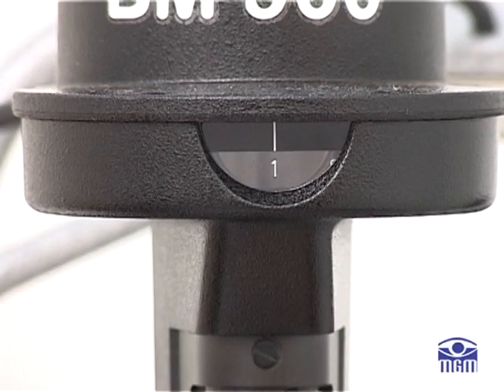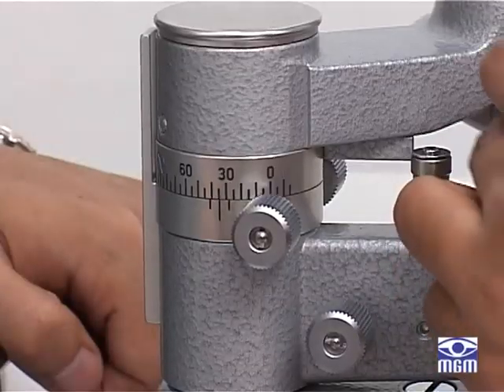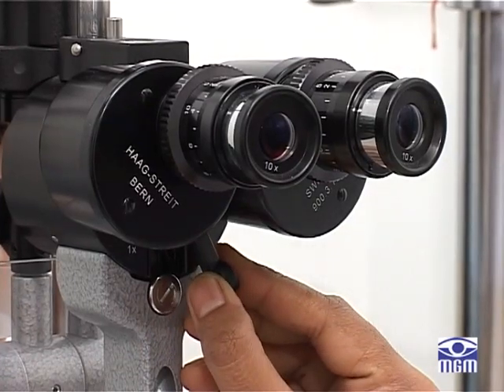Here the size of the beam is 1 mm by 1 mm. The light source is directed 45 to 60 degrees temporally and into the pupil. The illumination and magnification are the maximum.